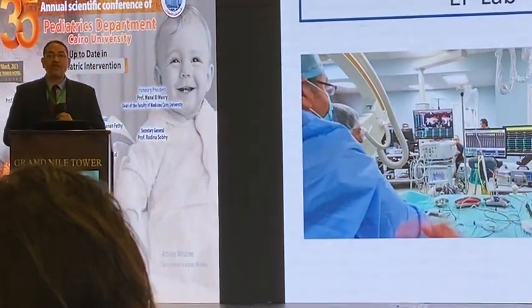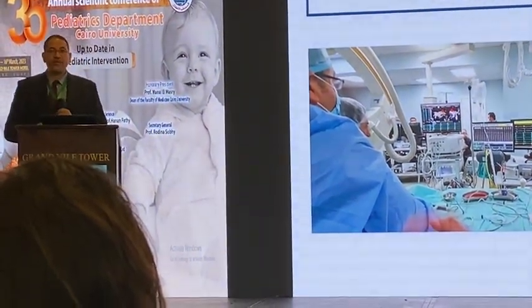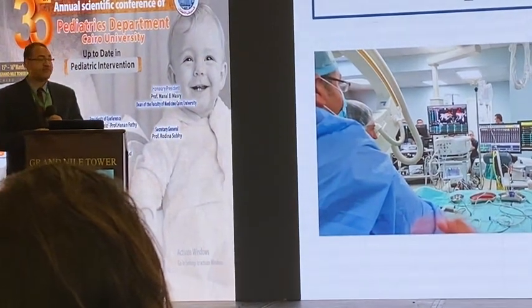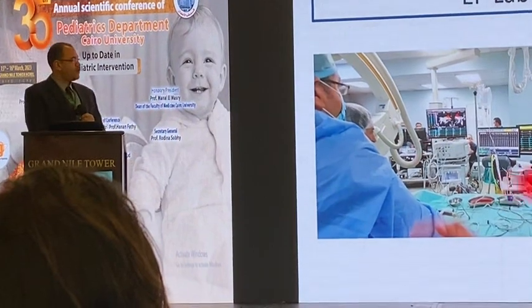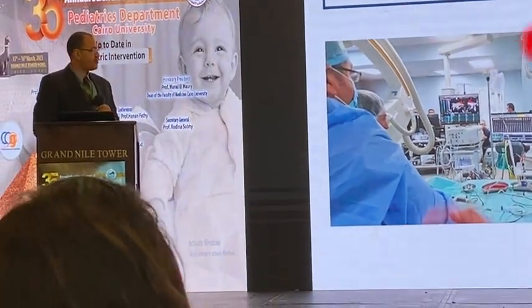So for those two patients, we decided to go to the cath lab to do electrophysiological studies and ablation. And this is the picture of our cath lab, a lot of monitors on the screen.